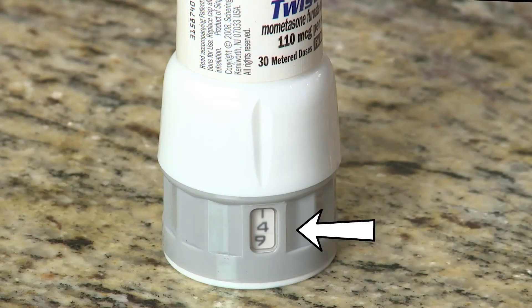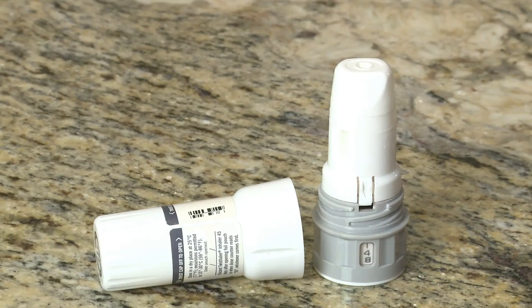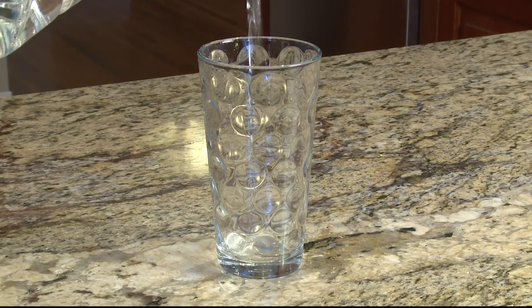Check your twist haler counter after every time you use it to make sure you have enough medicine for the next treatment. It is important to not waste your medicine — only take off the twist haler cap when you're ready to use it, because every time you open the cap, medicine is let out.